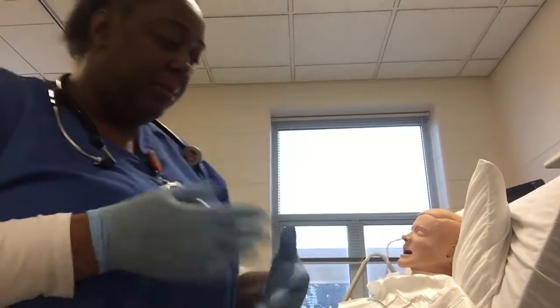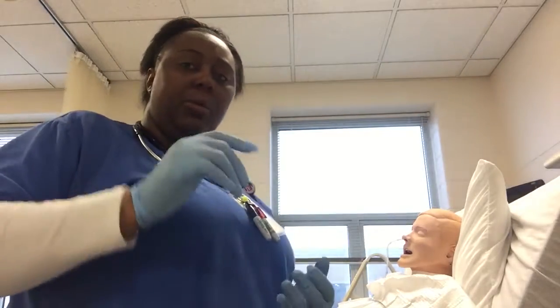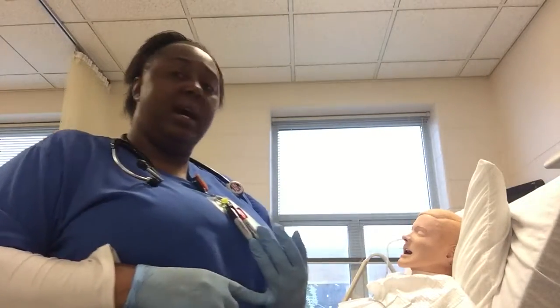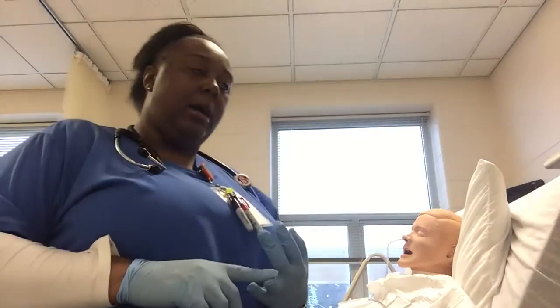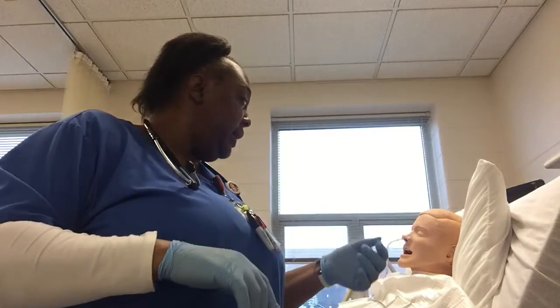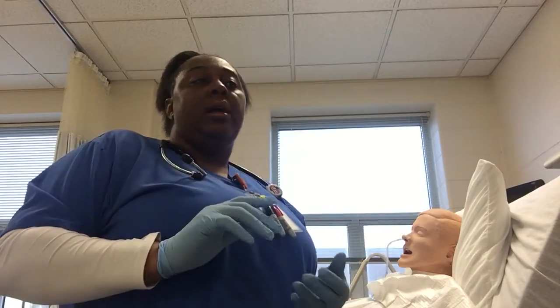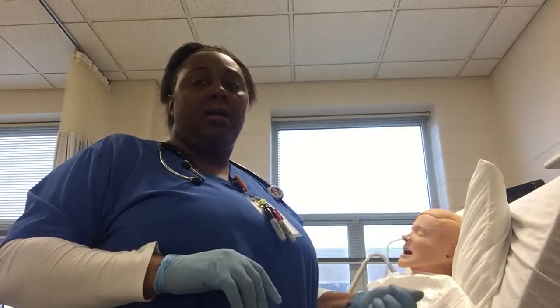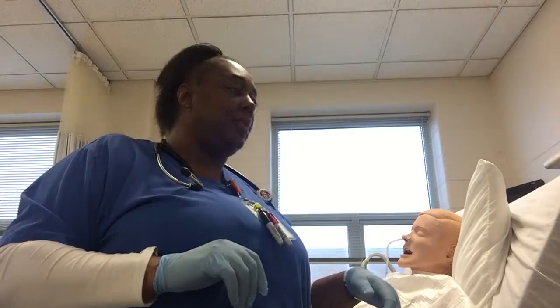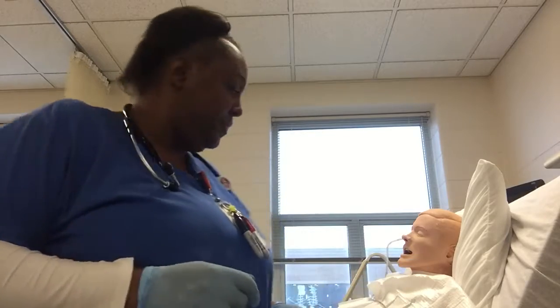I will clean up all of my supplies and then I will document the time that I placed it, the length of the tubing itself, as far as how far it's down, and then I will lower the patient down to proper body mechanics, give them their call light, make sure side rails are up, and that will end the insertion of the NG tube.